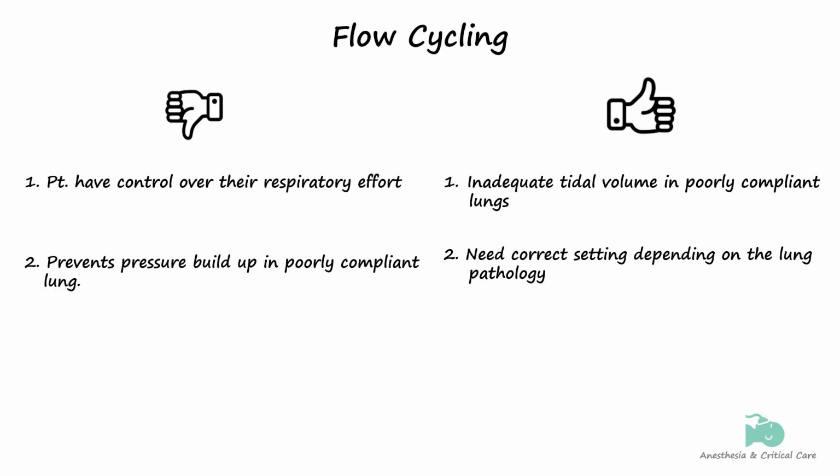Overall, flow cycling needs a good understanding of the patient's respiratory physiology and of the cycling setting on the ventilator for better patient comfort and outcome.